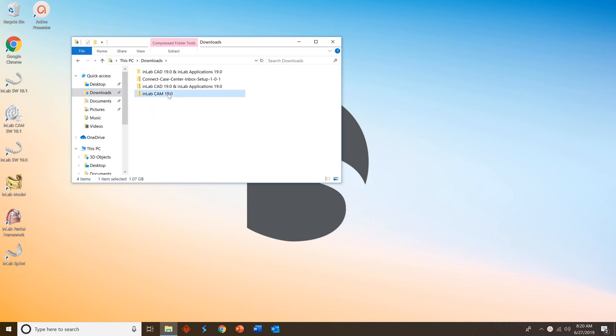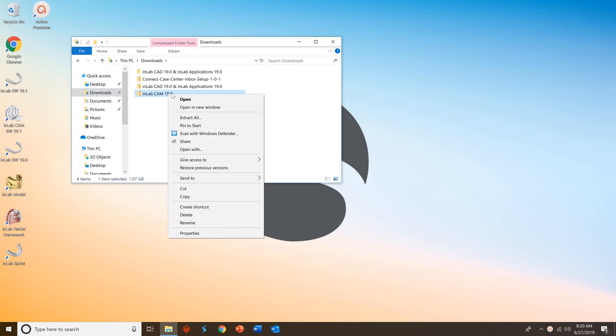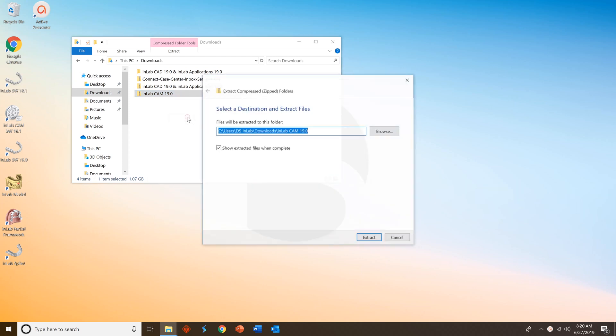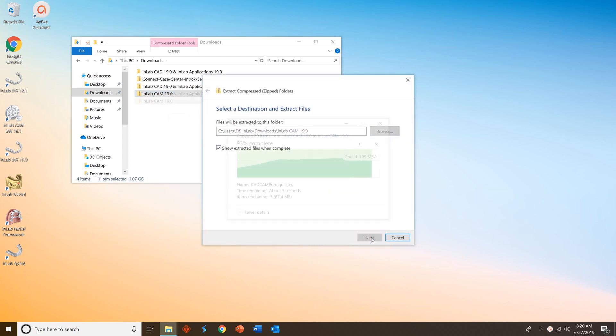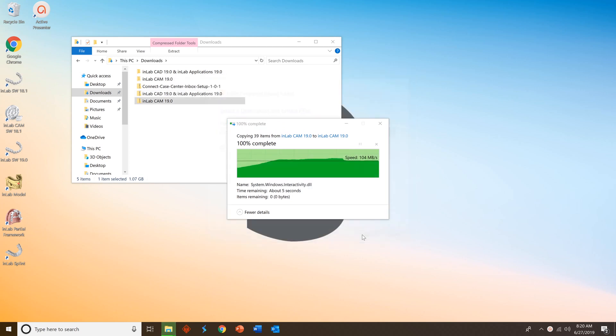Right-click it and select extract all. Make sure that the show extracted files when complete box is checked and press extract. This will extract the files.